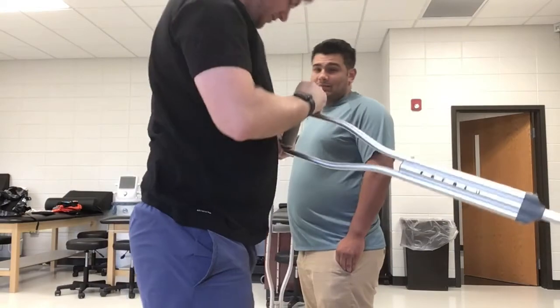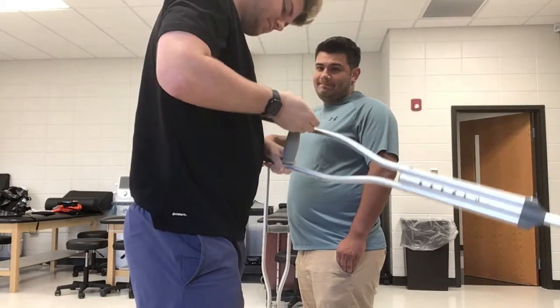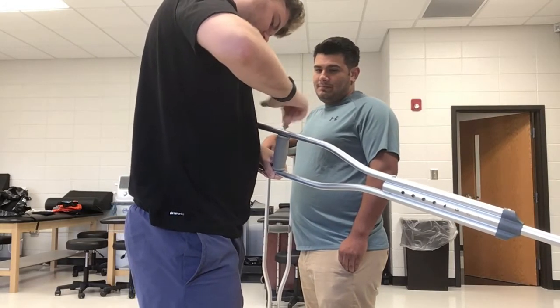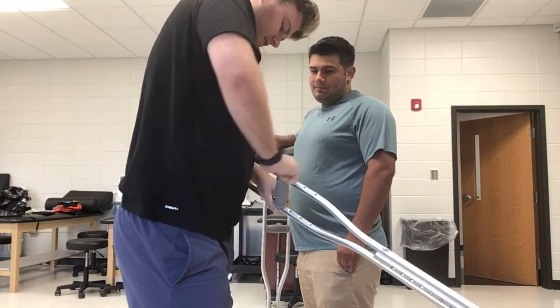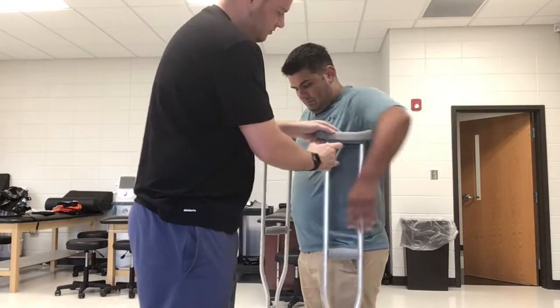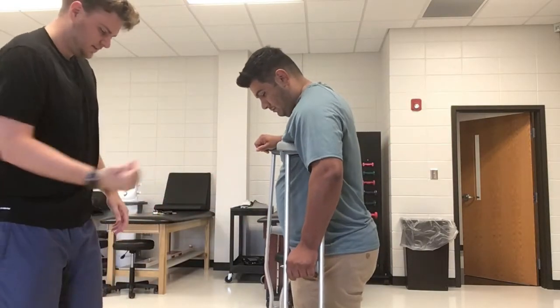Alright, well apparently crutches don't want to cooperate with me today. Yep. Yes, got it. Alright. So, I'm gonna put this back up on your arm, and then same thing, we'll go 6 inches out to your side, and then 6 inches forward.